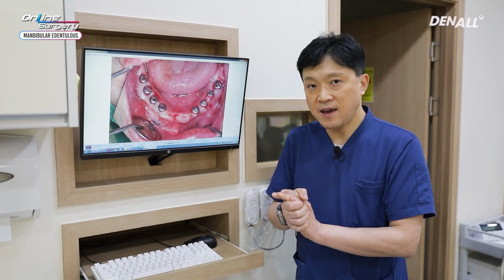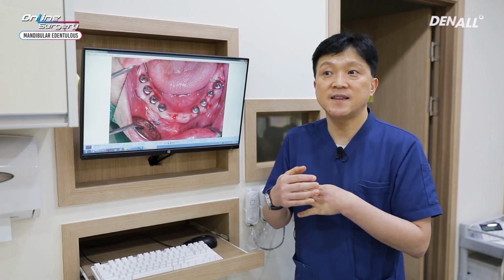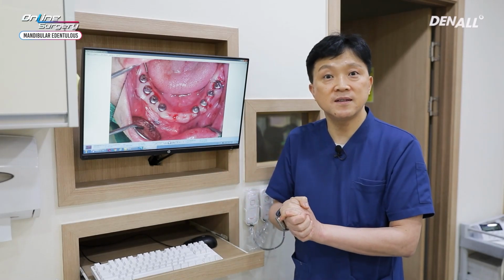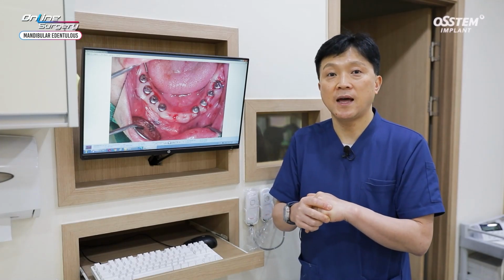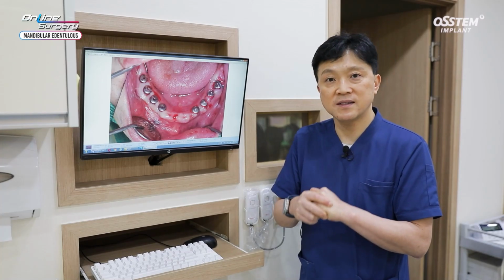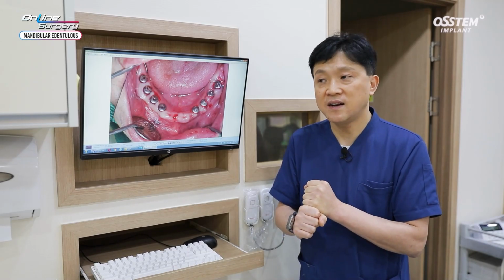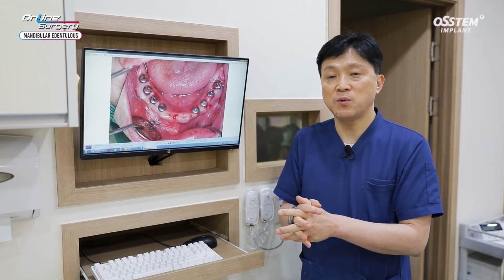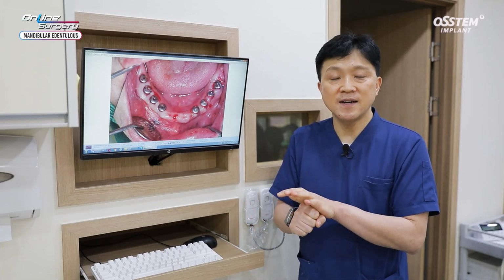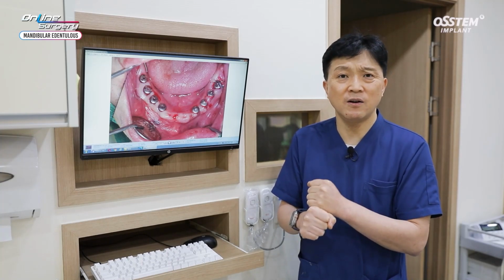When I first planned for implant surgery, the implant depths was designed to be about 1 millimeter deeper. In the case of a healed ridge, when you place implants, there's a higher possibility of drill being interfered by surrounding bone. When using OneGuide system, you can use flattening drill and then use initial drill. But as you've seen in this video, if you need to prep significant amount of bone using flattening drill, then it can be very difficult.